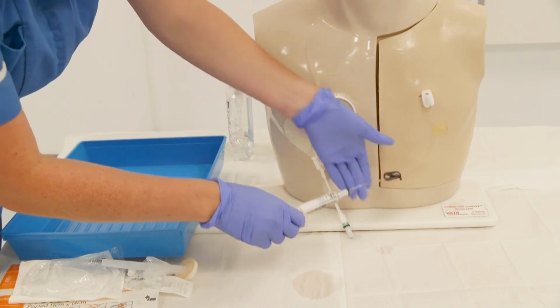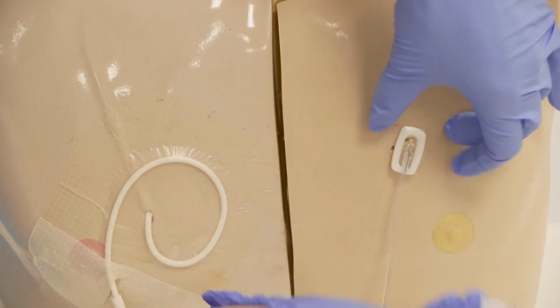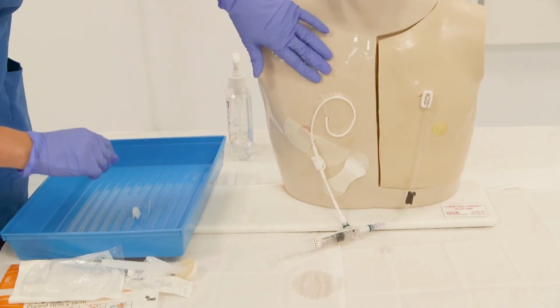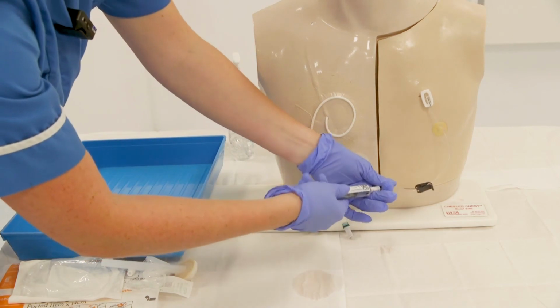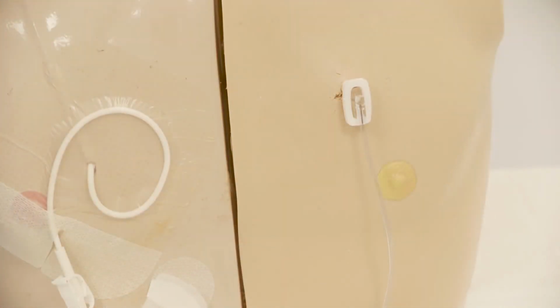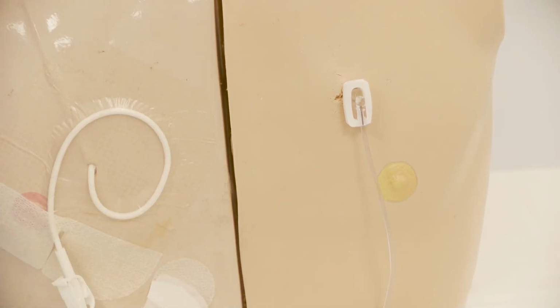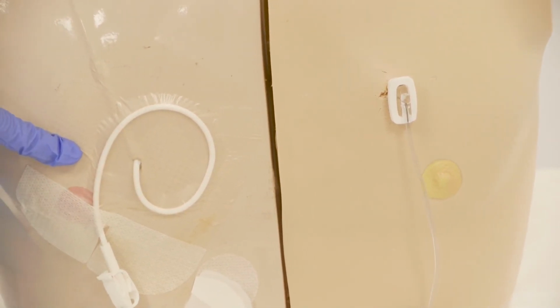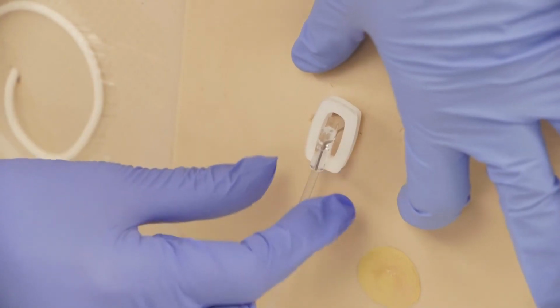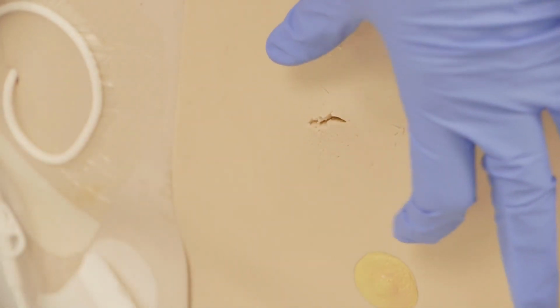This cap can then be taken off so that it sits flush to the skin, and the same dressing can be applied as on your other central line. Remove your line once you know that it works and it can be used. When you are going to deaccess a port, make sure that you flush the line through with saline and some Hepsal. Take the dressing off, a similar one as you would have for your Hickman line, and literally grip either side of the needle, press down against the patient's skin and pull straight out.